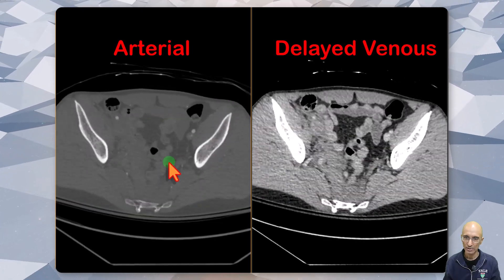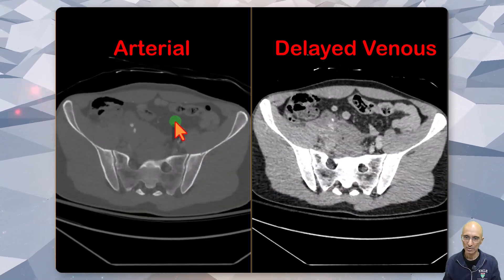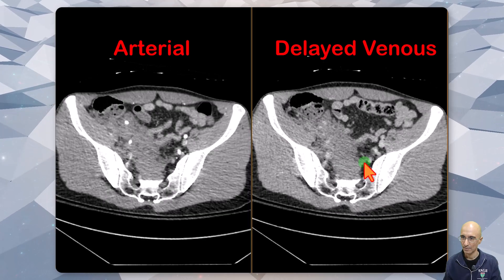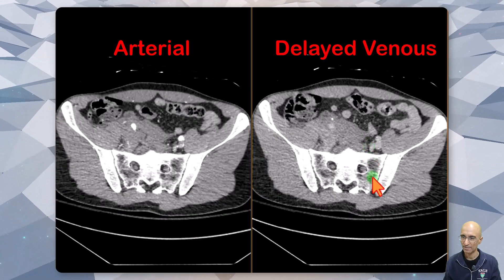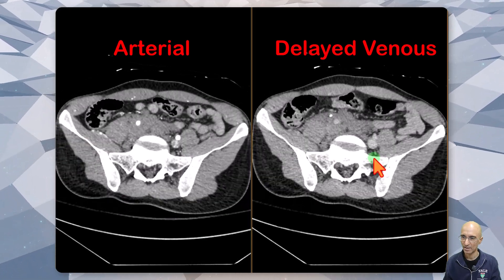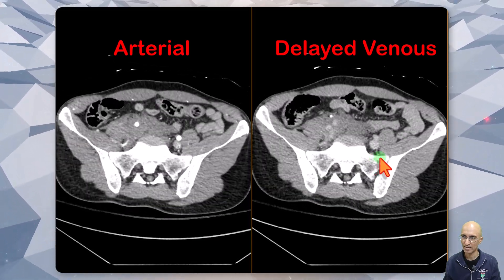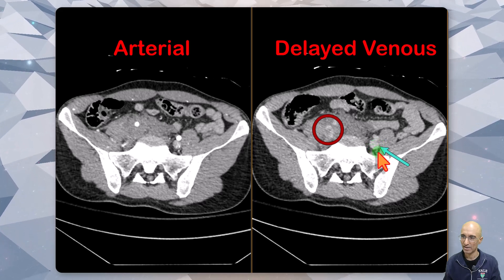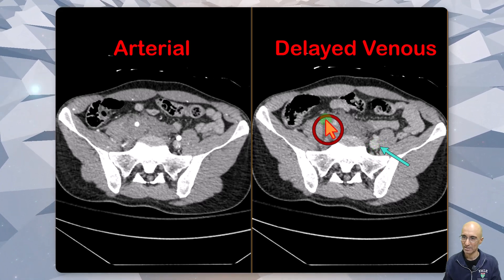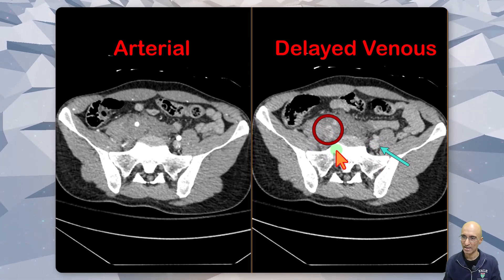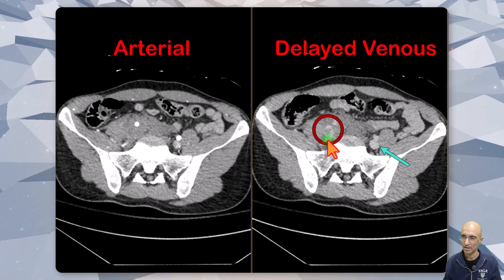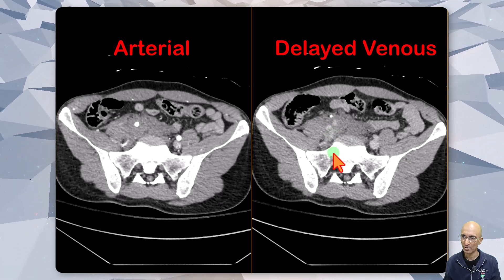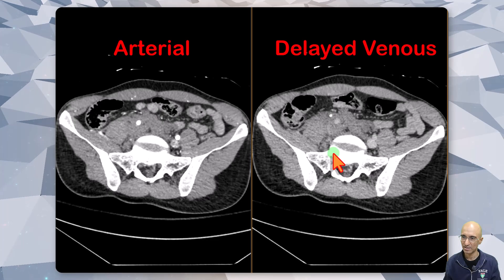On the bone window settings, there was no acute fracture identified in the pelvic bones. We also obtained delayed venous images. As I scroll through, you can see the normal left common iliac vein, but in the region of the right common iliac vein, no vein is identified. We see active contrast extravasation.